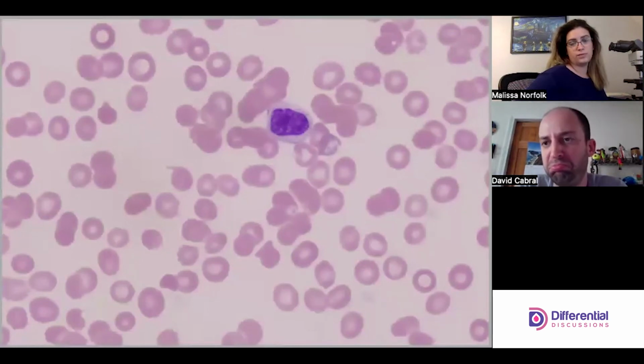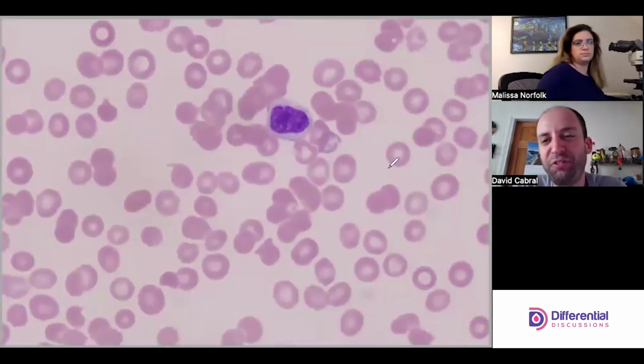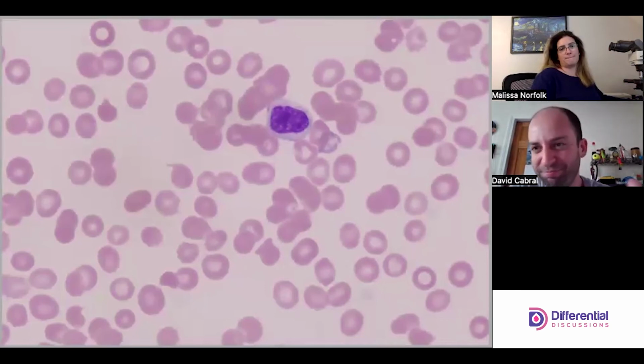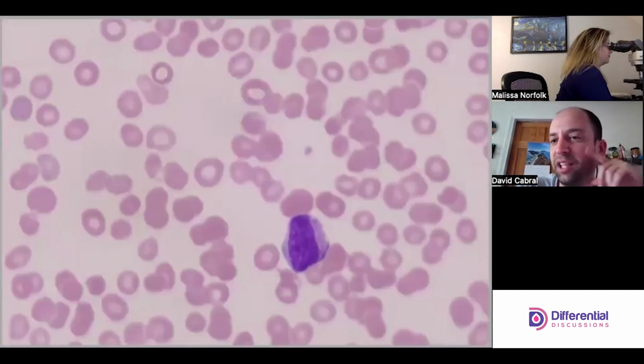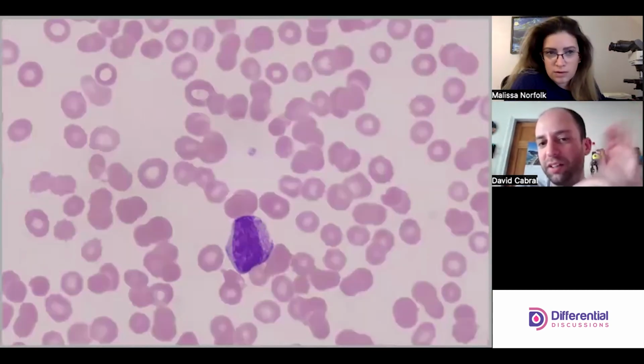He looks like a lymph. Yep. Yeah, some of the neutrophils, the cytoplasm is so light in color, and then some of the lymphs will be a little bit light, and then you get this weird look. This actually happens, I'm kind of thinking in memory, where sometimes lymphs and these myelos can kind of look a little bit like one another.